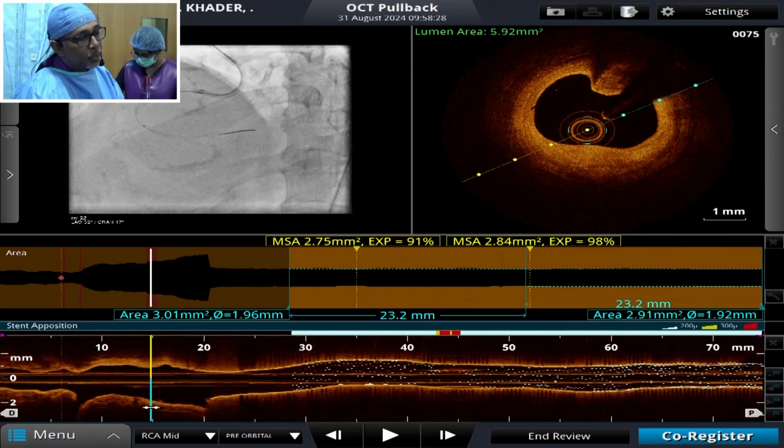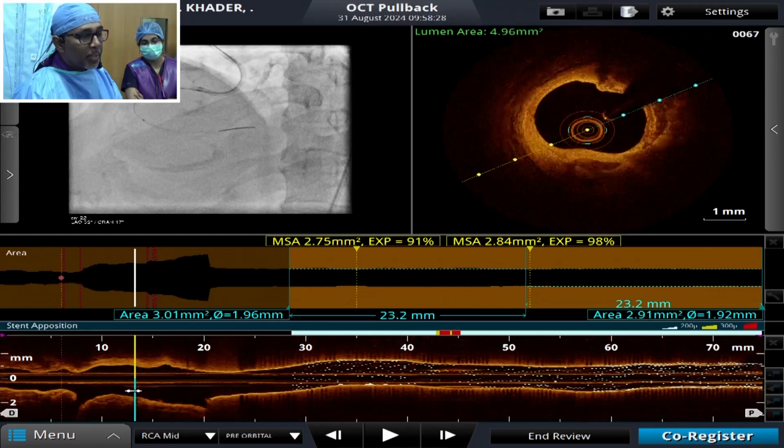Here you can see at the 12 o'clock position a nodule, but if you look carefully, the imaging catheter is far away from that particular nodule. Again, that nodule is not an occlusive nodule. It's a very small nodule. So mostly when you do orbital, it's not going to touch this area because it's a big vessel proximally, and it may not touch this area because the imaging catheter is much away from that particular lesion.